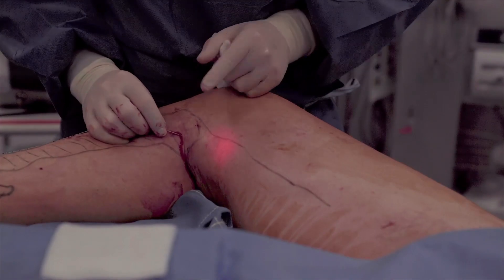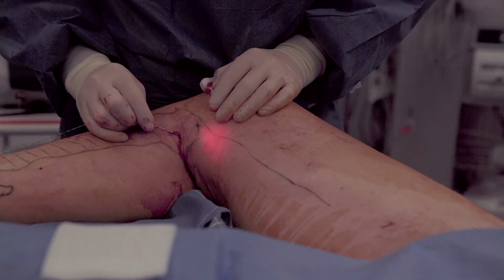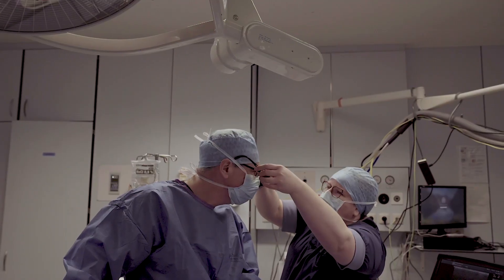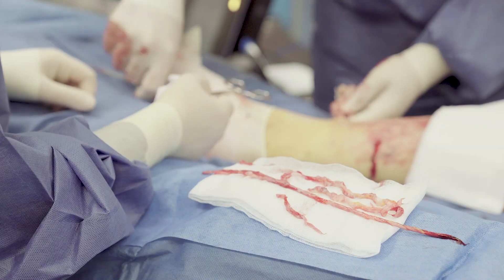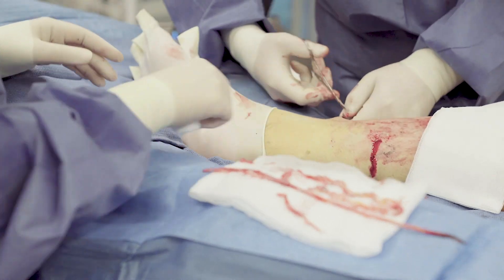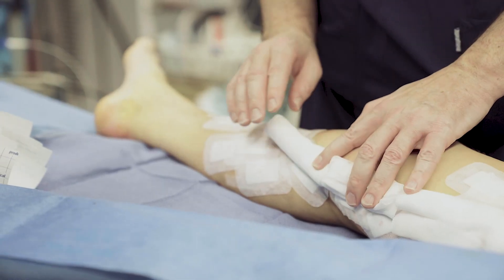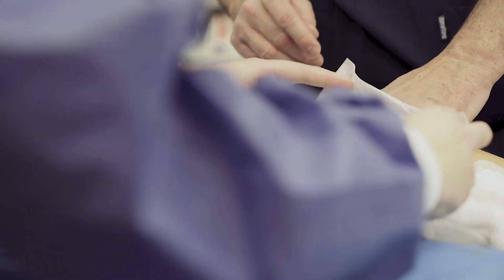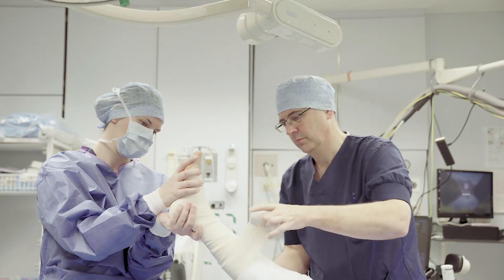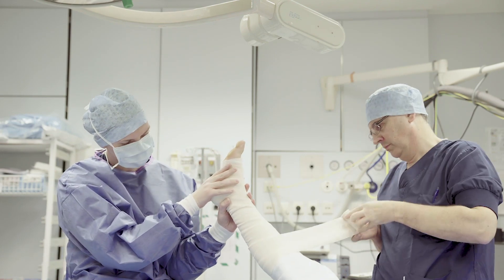Don't forget to pull back the needle catheter in time. Also note that the site of skin entry and the site of vein entry are not the same, so stop in time to avoid damaging the saphenous or sural nerve by lasering outside the vein. If necessary, additional phlebectomies can be performed. Finally, steri-strips are applied and we use extra compression along the lasered veins. Those gauzes remain in place for 24 hours and can be removed by the patient. A temporary bandage is replaced by a compression stocking before leaving the hospital a few hours after the operation.